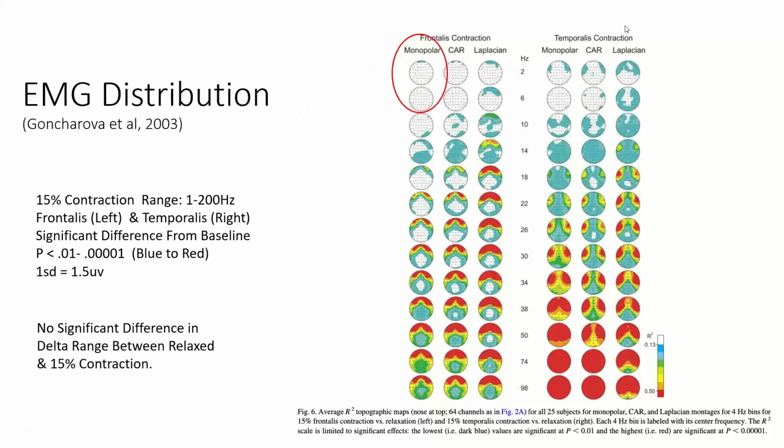which I think is really cool. Here we have monopolar, which is what we use. In other words, when you're doing QEG with us, you're usually doing monopolar. In some of the other softwares, you can do Laplacian montages and all kinds of other montages, which is great if you're doing research. I don't find them that useful for clinical neurofeedback. I would if I was a neurologist, however. But neurofeedback, I think our monopolar works more than well enough for what we're doing.